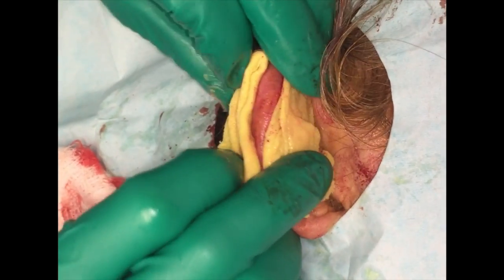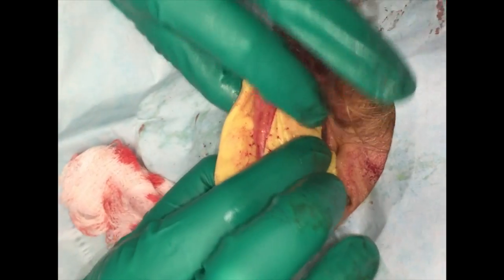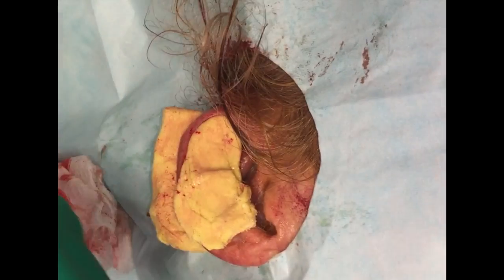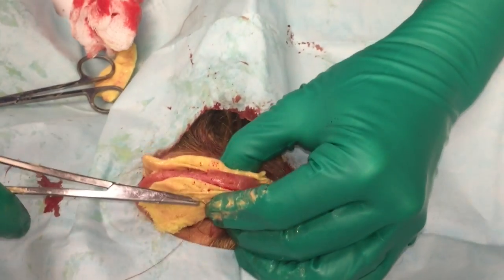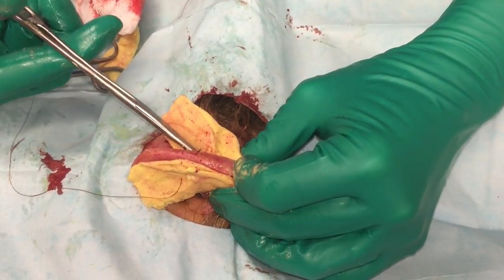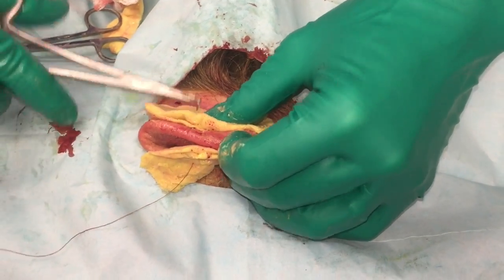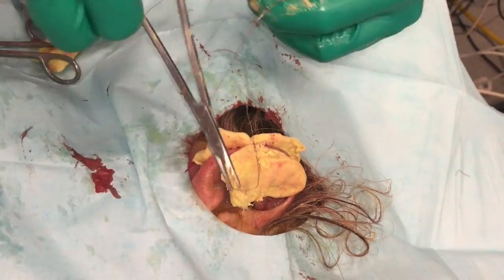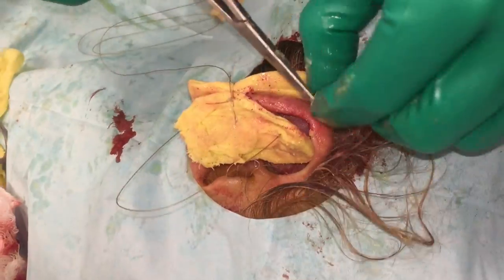Fill all external auricular crevices with Vaseline gauze, then place three to four layers of gauze behind the ear as a posterior pack. Using either Vaseline impregnated gauze or dental rolls, pass a 4-0 nylon suture through the entire thickness of the ear and over the hematoma. Wrap the suture around the roll or gauze on the posterior aspect of the ear and then pass the needle back through the pinna. Wrap and tie the suture around the second roll or area of gauze on the anterior aspect of the pinna. The dressing should firmly re-approximate the perichondrium to the cartilage without compromising the vasculature. This dressing will be removed in one week.